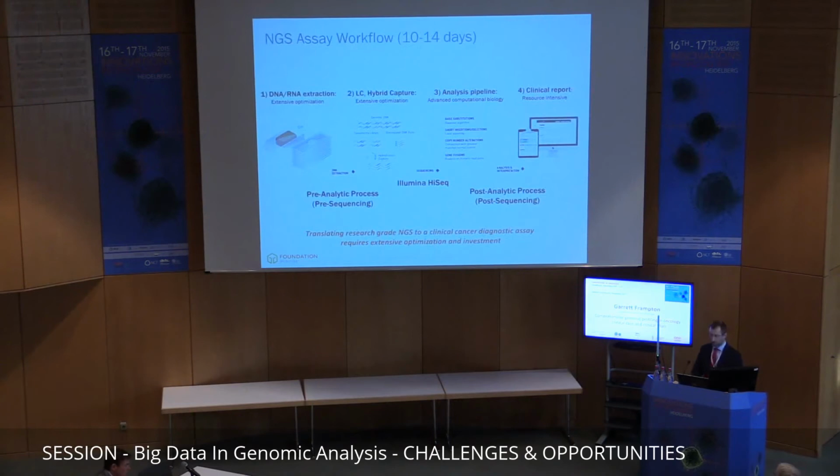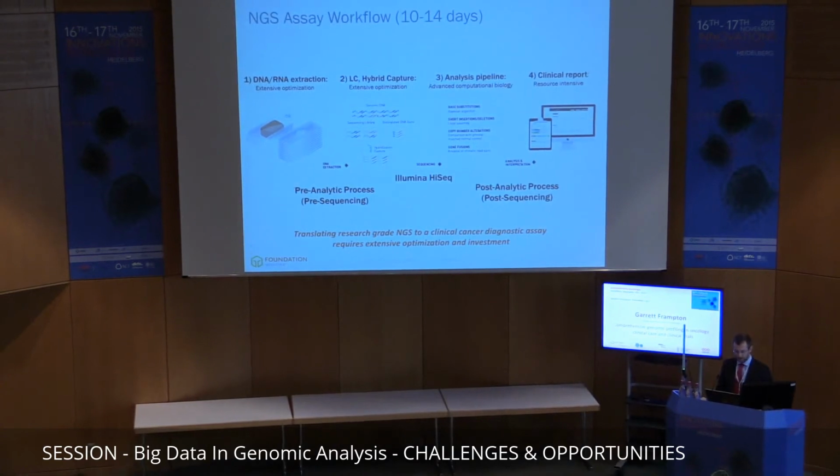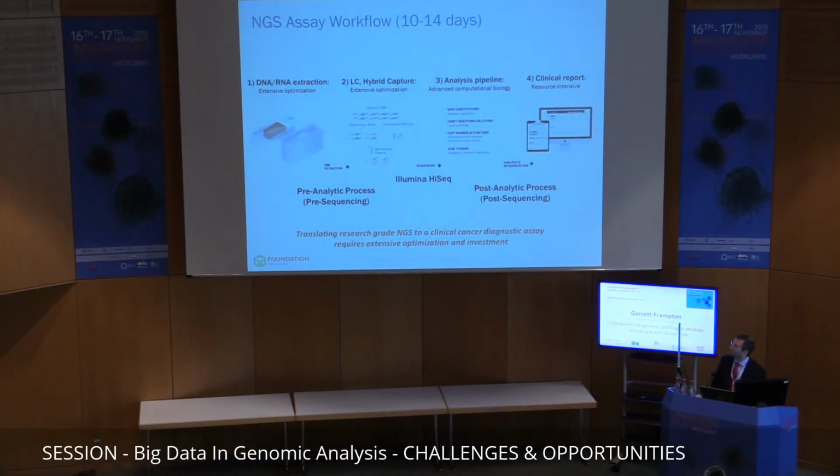So Foundation was a company started 5 years ago to create a diagnostic test to meet these challenges. And I'll just go very briefly through the workflow. You start by extracting DNA from the generally available biopsy specimens, starting with as little as 50 nanograms of input DNA.